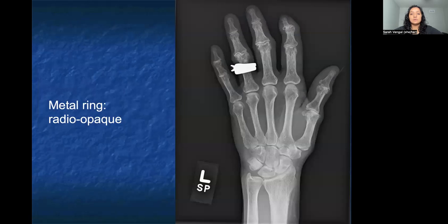In this example, we have a radiograph of a left hand. As you can see, the metal is something that appears as bright white, which is very typical for something that's radio-opaque. So this person has a radio-opaque object in a circular manner around their finger, also known as a ring.